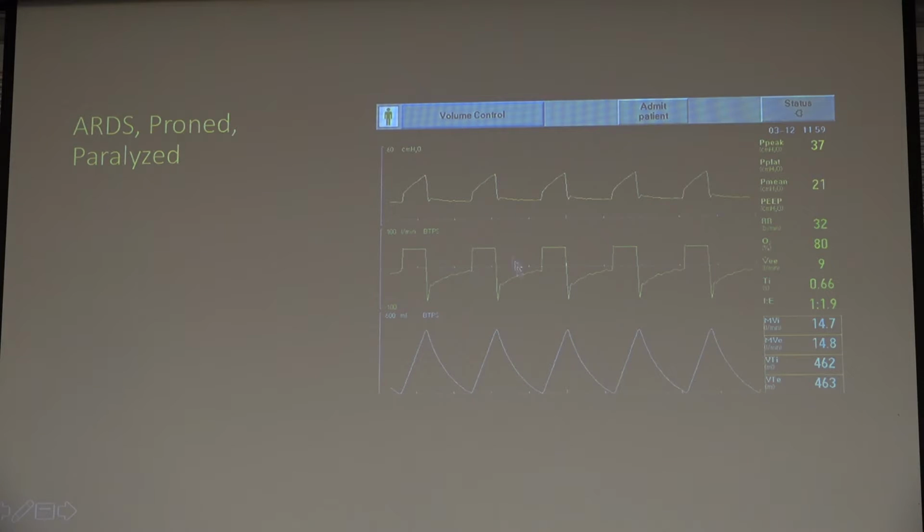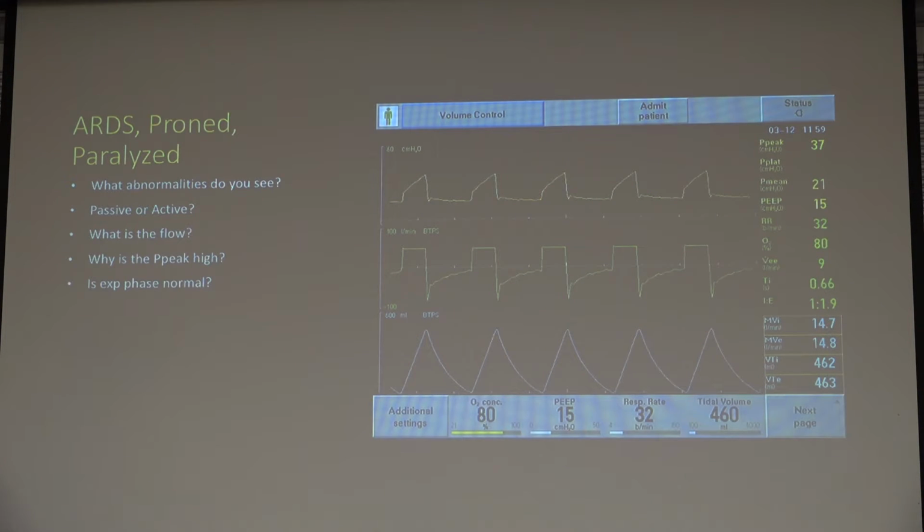But again, this is the patient that, because inspiratory time is so long, we've now run out of expiratory time for this patient. And this is the patient that has persistent expiratory flow at end expiration, suggestive of auto-PEEP. And again, even though the asynchrony is not a problem, the low flow rates result in high inspiratory times and therefore decreased time for exhalation. Sorry, go through those things.